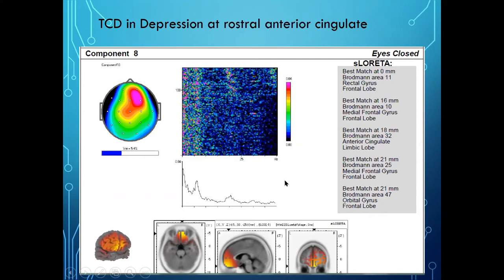So this component isn't a big one. It's only 5% of the variability of the EEG, but it's a clinically relevant one because it shows the dysrhythmia. And it points directly where you would target your TMS target. It's not the cognitive division at FZ. This is actually an FPZ or an AFZ target. It's further forward. And you can point your magnet at that and actually pulse it. And 10 would do because the primary low frequency is slower than that. And it would basically break up this pattern. If you're shooting beam F3, assuming that the left frontal is going to fix this, this patient doesn't have that. This patient has the thalamocortical dysrhythmia marker at the anterior cingulate.